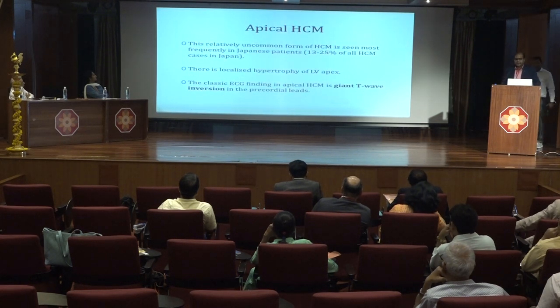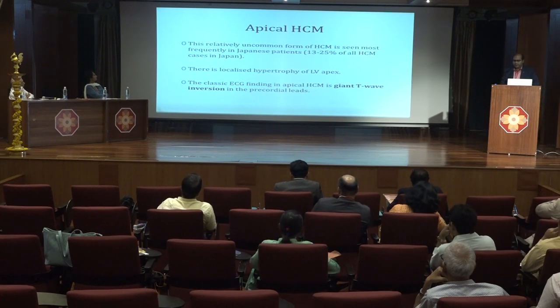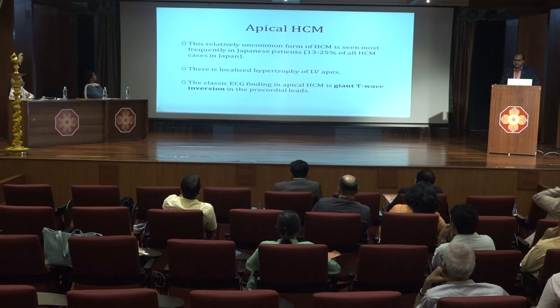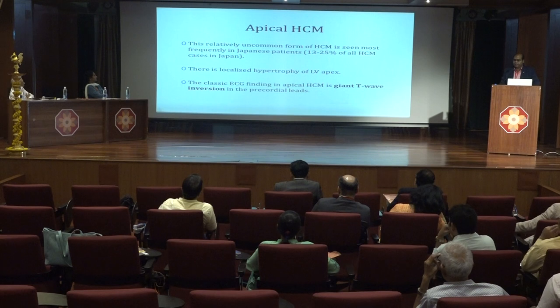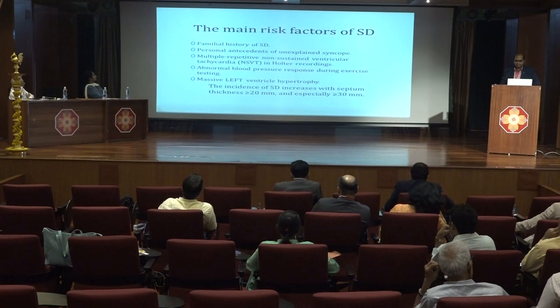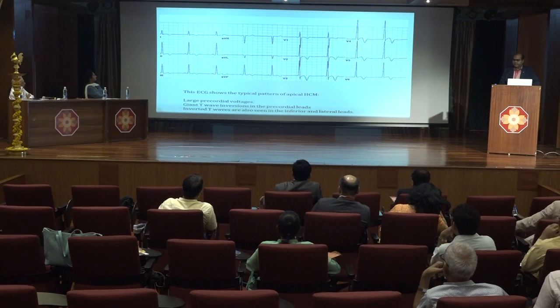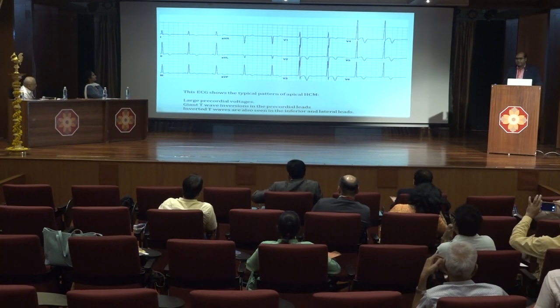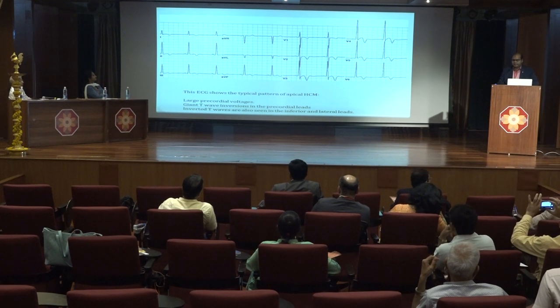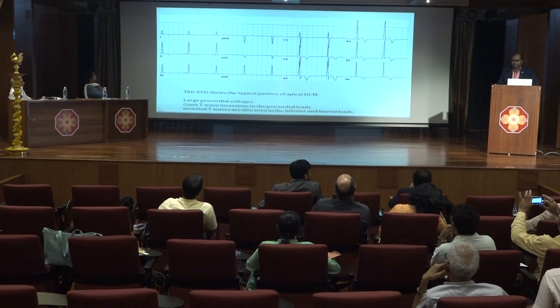Apical HCM is a relatively uncommon form of hypertrophic cardiomyopathy. It is seen more commonly in Japanese patients and is characterized by localized hypertrophy of the LV apex. The classical ECG finding of apical HCM is giant T wave inversion in the precordial leads. In this typical ECG of an apical HCM patient, we see voltage criteria matching for LVH and deep T wave inversions in all precordial leads from V2 to V6.